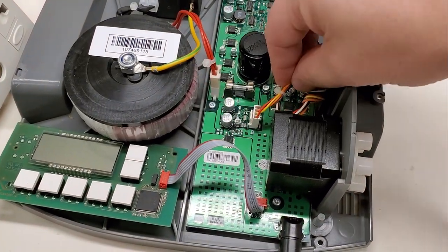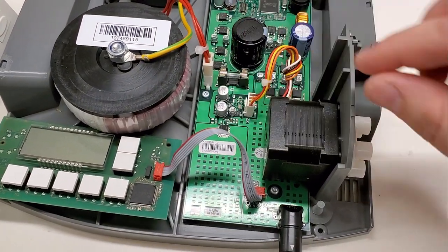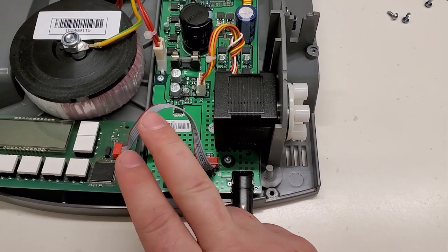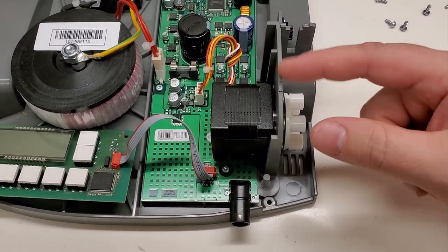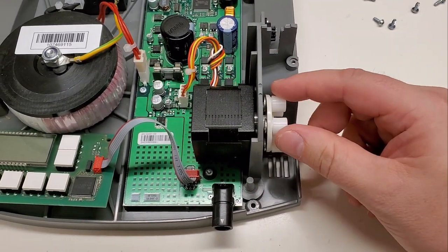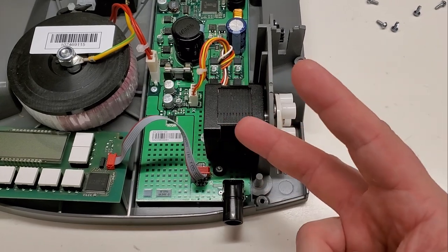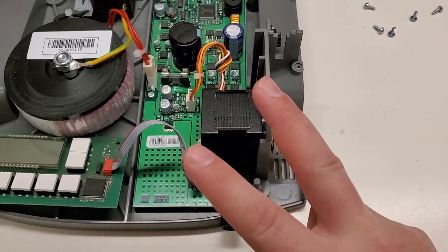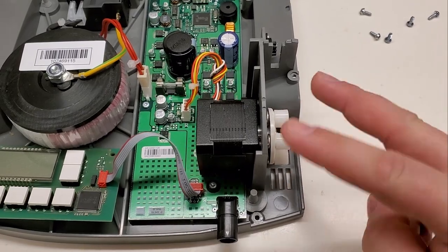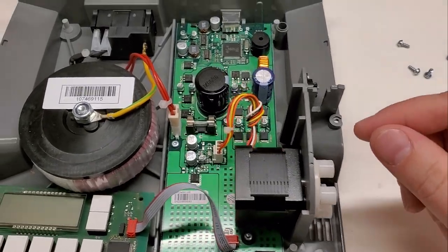Now, the stepper motor, it's got four wires. And that's because two wires go to one coil and two wires go to the other coil. So there's technically two coils in this motor. And what it does is it alternates between the two coils, which is how your motor spins. It alternates back and forth very, very quickly.